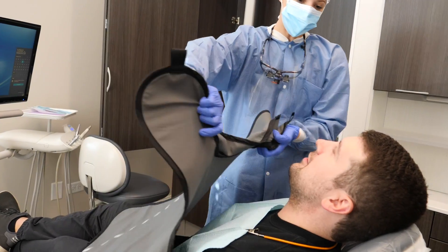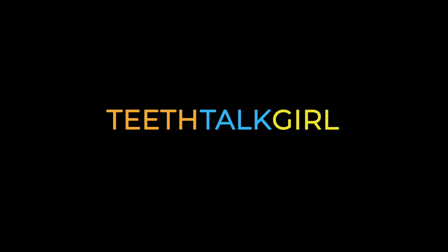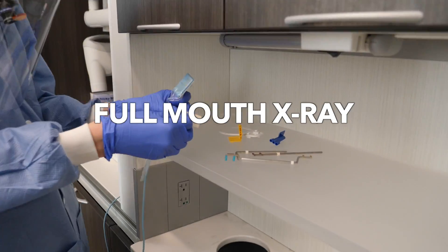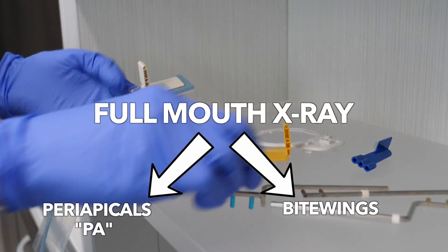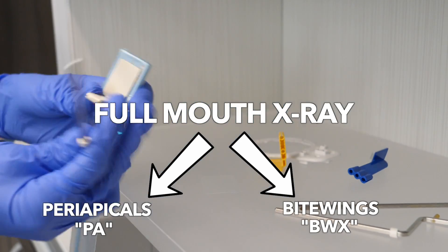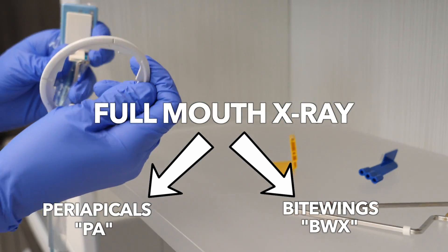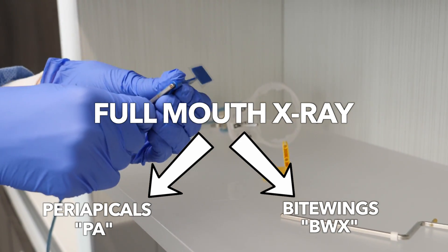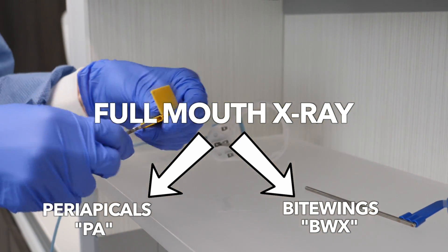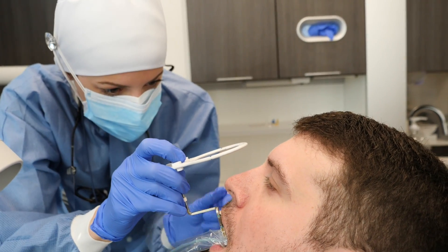This video is going to show you a full mouth x-ray, or FMX, at the dentist. A full mouth x-ray is a series of periapical PAs and bitewing BWX images to capture a full mouth picture of all areas and teeth in your mouth. We'll talk more about the differences between PAs and bitewings as we go along in this video.